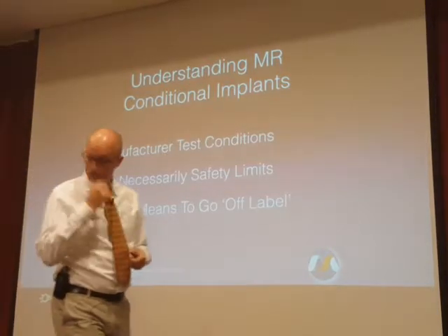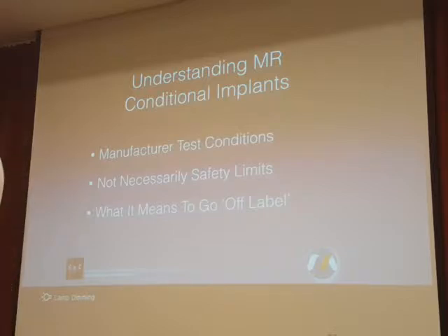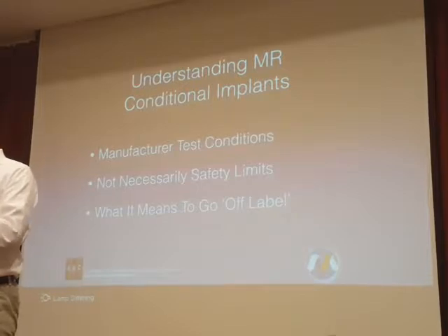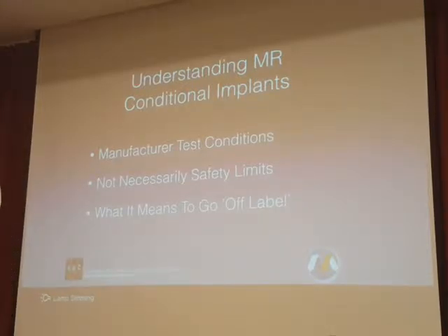Yes, I have a question about the neurostimulation. Should this be set before scanning, or is there a compatible one with no need for settings before that? So, the question is for neurostimulators. Do we need to put them into special MRI settings before imaging them?